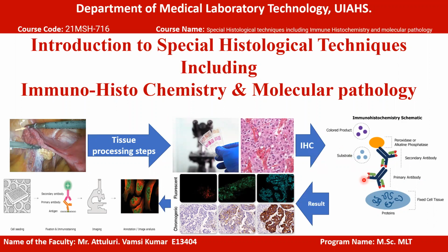Then after antigen retrieval and endogenous blockage, we stained with primary and secondary antibodies. Upon staining, we got visuals like this in the microscope. And also we have counterstained with H&E staining. So immunohistochemistry is all about detection of target antigen in the tissue with the help of specific antibody.